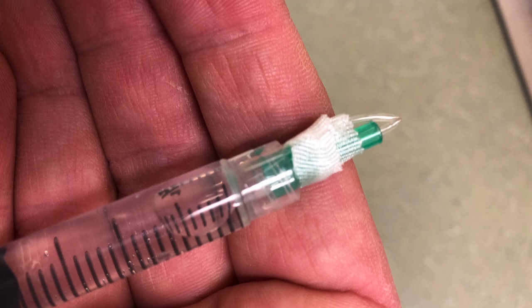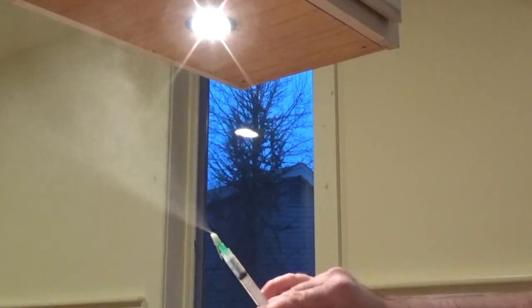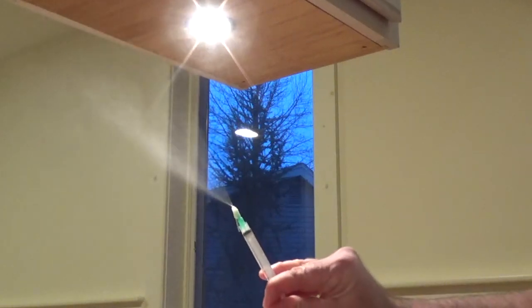Now screw the angiocath onto a 3cc syringe containing your medication like this. You have to push pretty hard on the plunger for this to work, so it's difficult if you use larger syringes. The atomized medication usually does come out at a slight angle, but in the close confines of the nose, it doesn't really matter much because everything's just ricocheting off everything else.